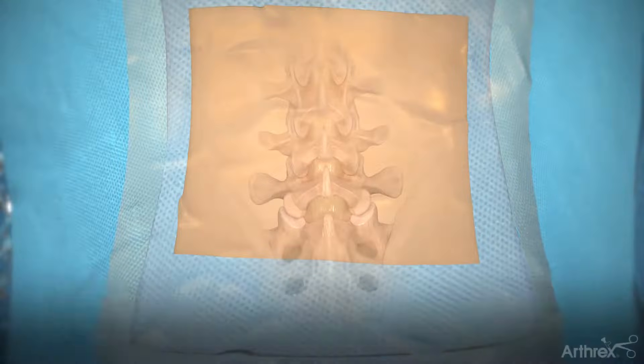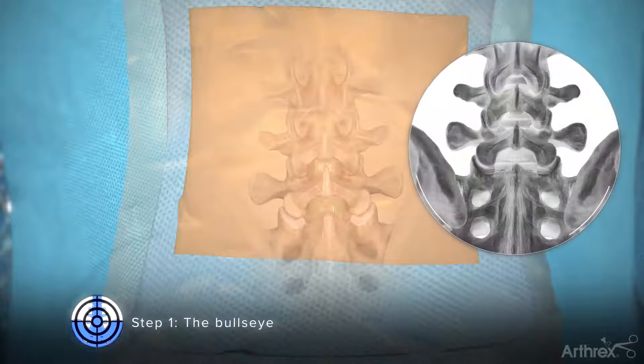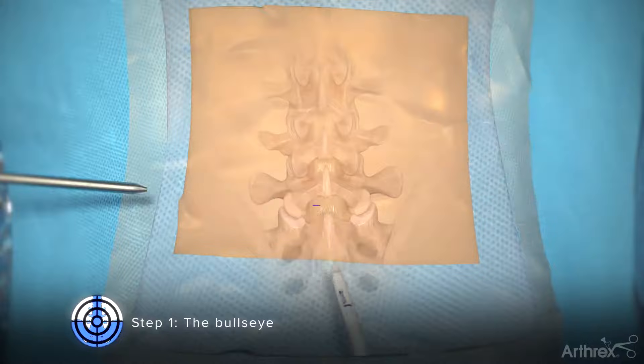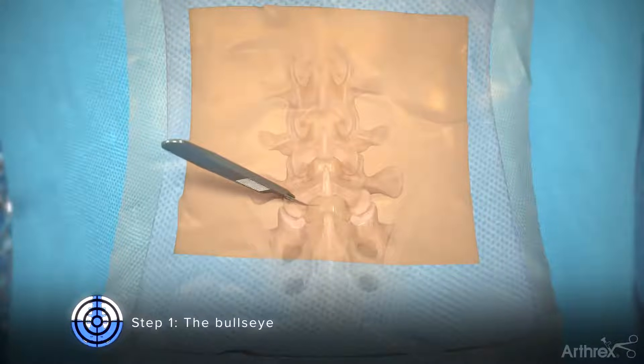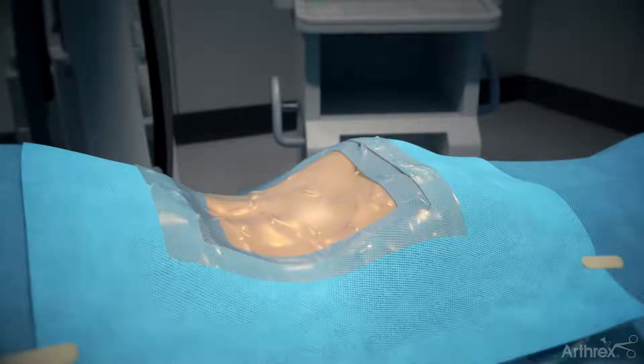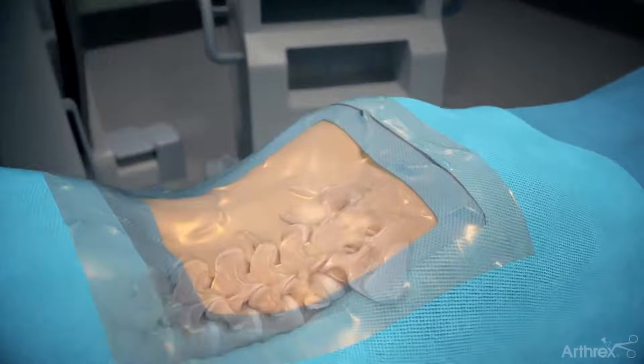Step 1: The Bullseye. Use a switching stick to identify the entry point, which is the lateral aspect of the ipsilateral interlaminar window. Make an incision between 8 to 10 millimeters through both the skin and fascia. An alternative method utilizing serial dilators can also be used.